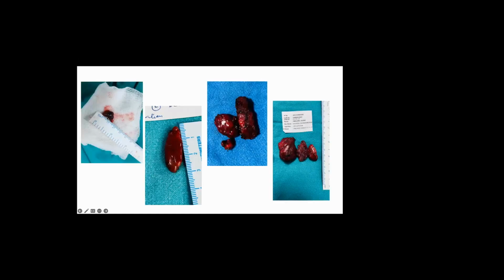See this, it could be as small as 1 centimeter or 3 centimeters. Here, in this patient, these lymph nodes were identified, and some of them I had sent for frozen section. They said there is a metastatic deposit from papillary thyroid carcinoma. So then we did a right hemithyroidectomy along with parathyroidectomy in this case.